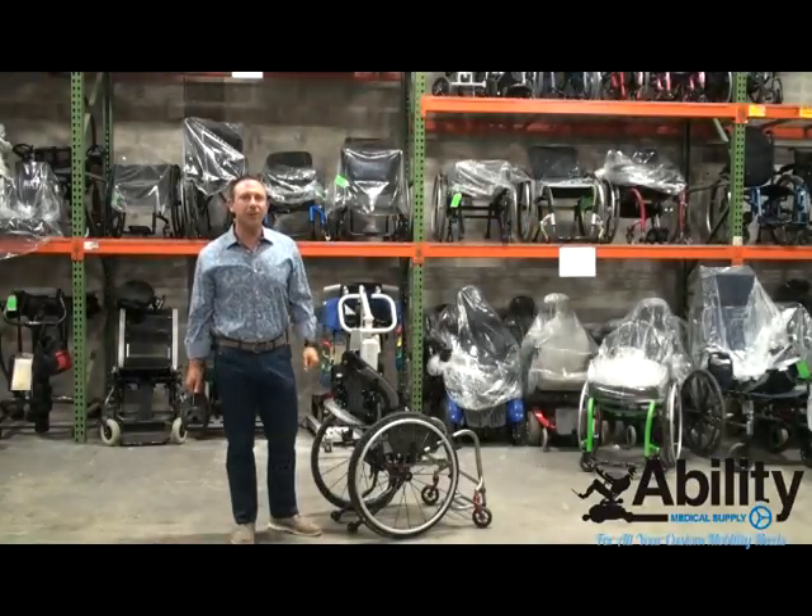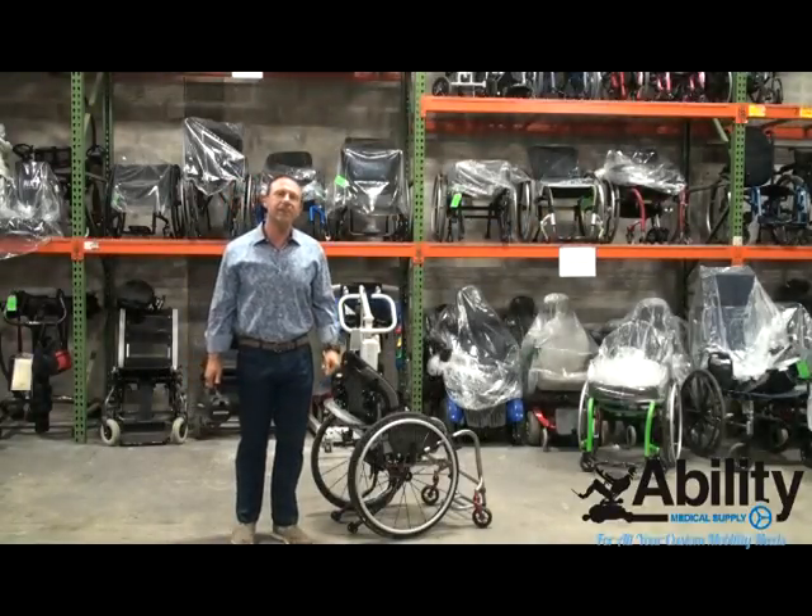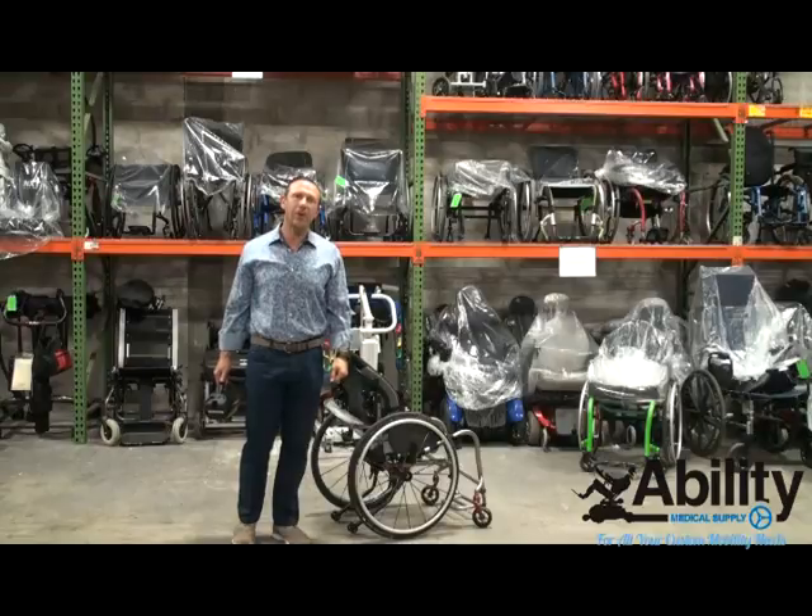Hello everybody. My name is Jed Golding. I'm the Director of Rehab for Ability Medical Supply. We are the leading provider of complex rehab products for the entire state of Florida.